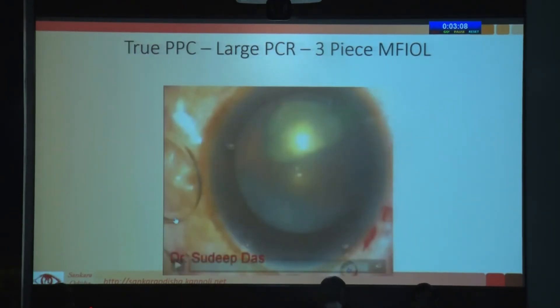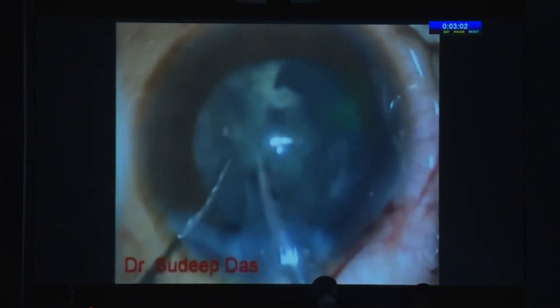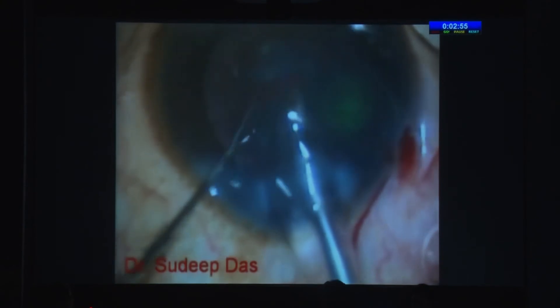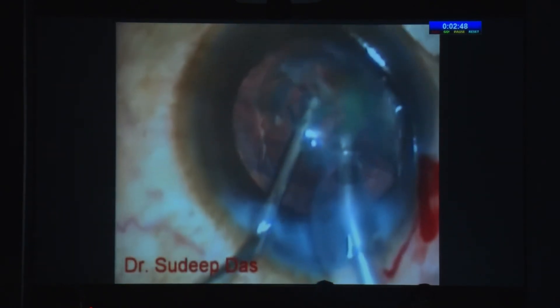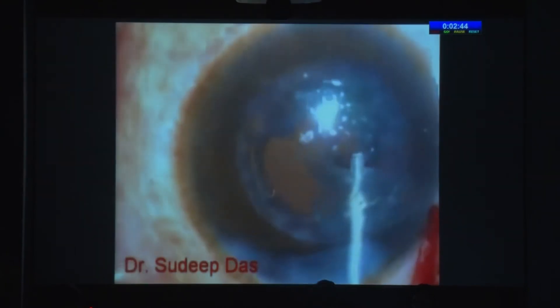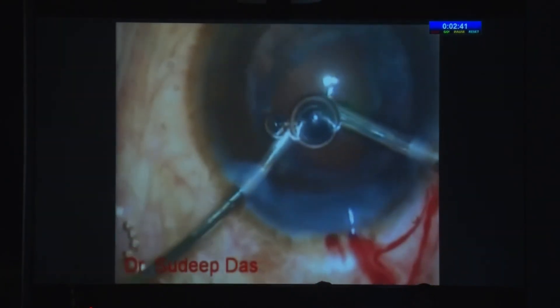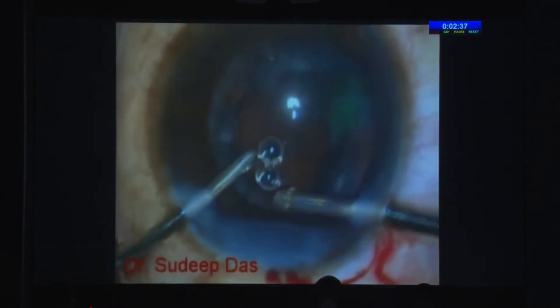This was a very large PPC. When you see such a large PPC, you can actually expect the PC to go at some point. I'm removing the epinucleus now, and that's when the PC opens up. I'm still holding onto the epinucleus on my phaco tip — still in position 2, not position 3 — because if I leave it, it's going to go into the vitreous. So once I inject viscoelastic, I viscoexpress it out, then do a proper vitrectomy.